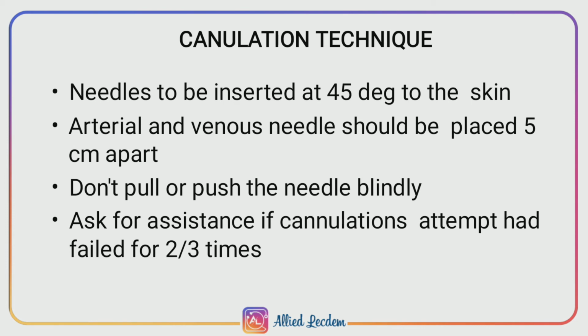The cannulation technique: needles are to be inserted at 45 degrees to the skin. The arterial and venous needles should be placed 5 cm apart. Don't pull or push the needle blindly. Ask for assistance if the cannulation attempt has failed 2 or 3 times.